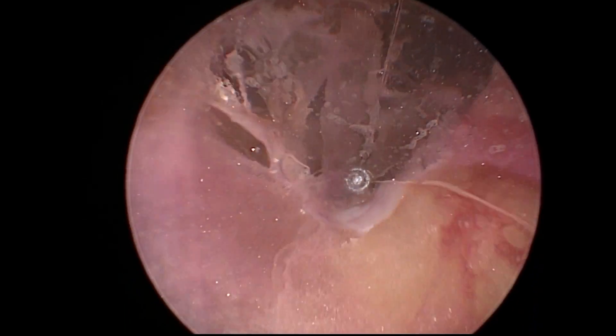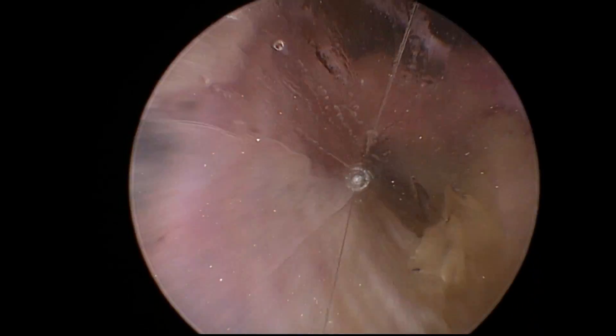I cauterize a little bit of adventitia and then I'm ready to continue my dissection.